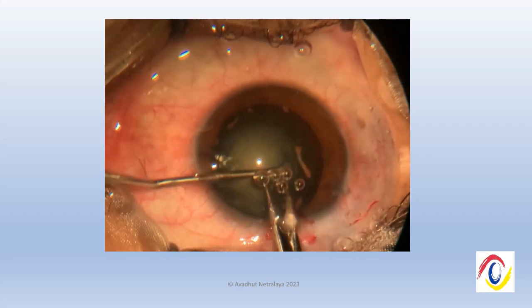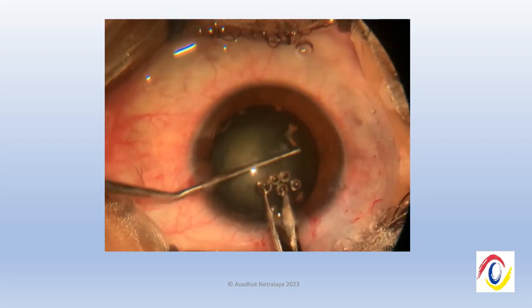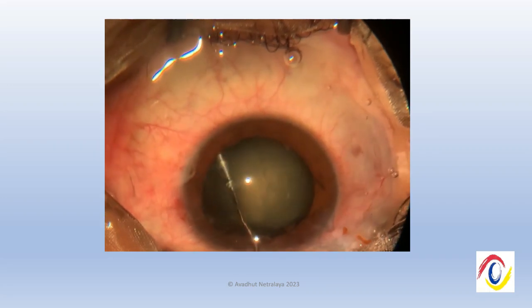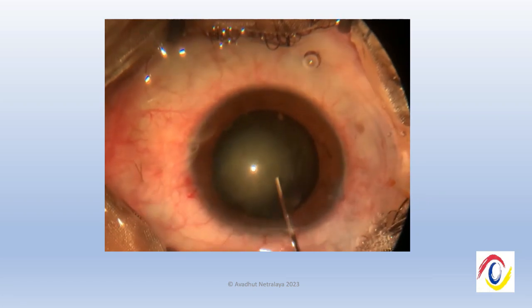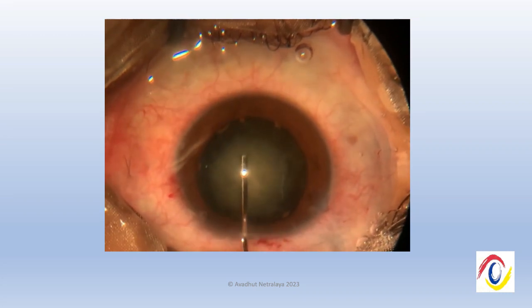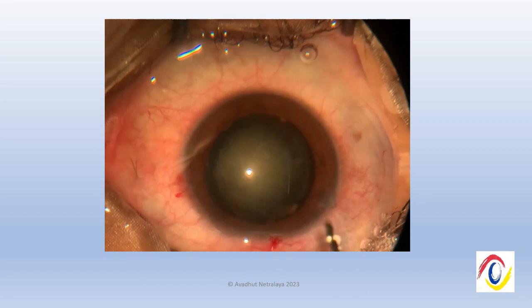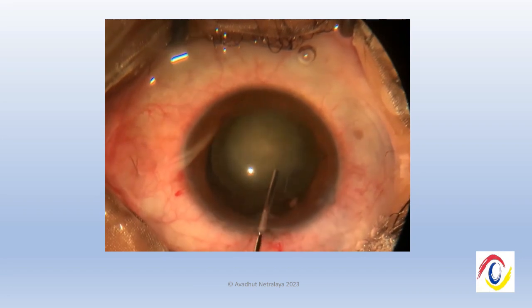We ensured that the capsulotomy was complete using intraocular scissors to cut the capsular remnants. During the hydrodissection procedure, the nucleus gradually popped up. An important finding during surgery was the presence of cilia in the subconjunctival space along the nasal part of the sclera, which we thought was perhaps the entry wound for the iron foreign body.